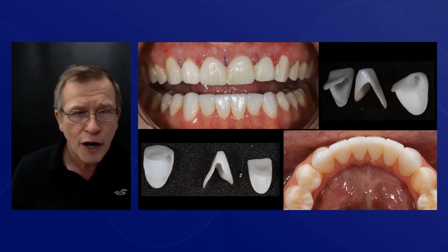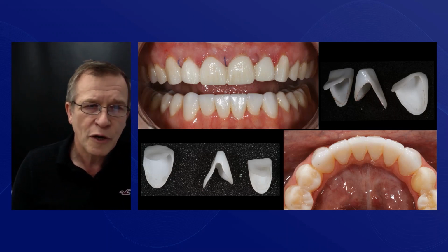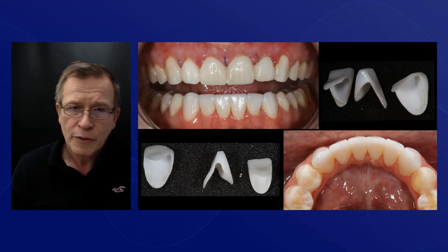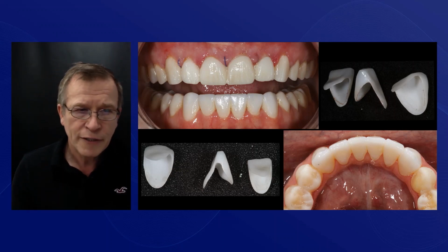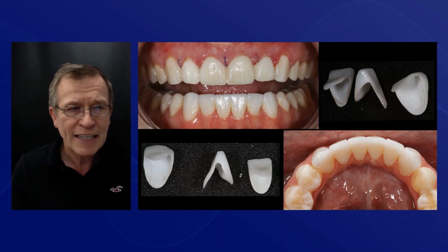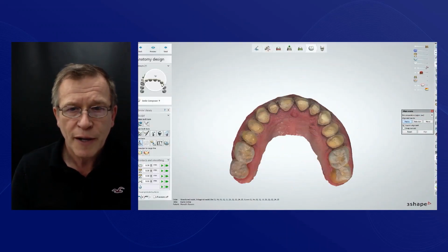But people say that you can't do minimally invasive dentistry digitally. I mean, that is not the truth. You do need to know what you're doing. You need to work with a good laboratory, of course, but with the right people, we can get beautiful, beautiful results. And we can actually really understand, hopefully, if I can skip through this presentation quick, you'll see at the end, we can know exactly how much space we have for our restorations to make sure that everything is going to work really, really well.